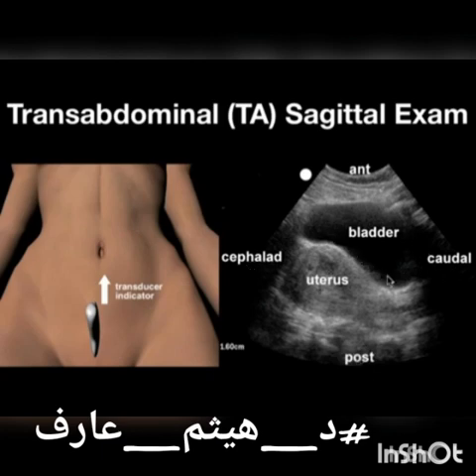Here you've got urinary bladder in the near field. You can see some reverberation artifact here, which is common. Here you can see the uterus here, which is anteverted. You can see the myometrium here, and you can see the hyperechoic endometrium here. This is going to be the posterior cul-de-sac, and this is going to wrap around here into the anterior cul-de-sac here. Down here you've got the cervix, and here you can see the vaginal stripe.